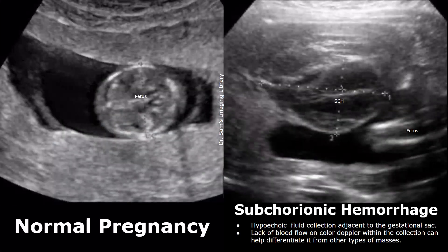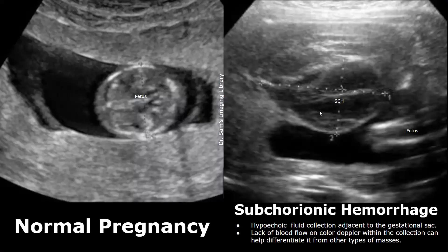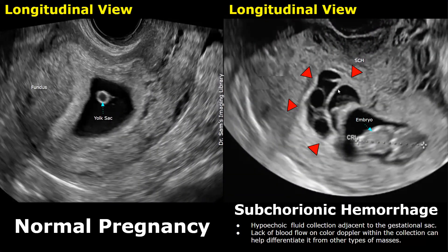This was a subchorionic hemorrhage. It appears as a hypoechoic heterogeneous fluid collection and did not show any internal vascularity on color Doppler. This hemorrhage appears multiloculated — this type of appearance can also be seen in an SCH. It is a large hemorrhage and carries a high risk of pregnancy complications.